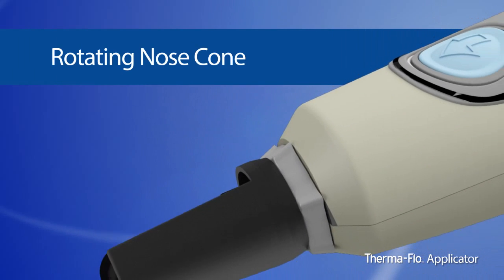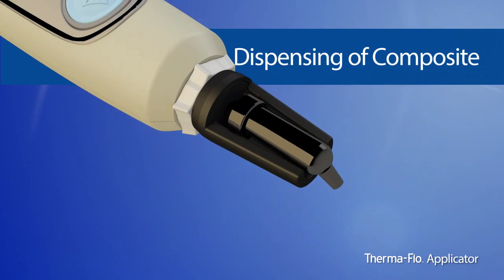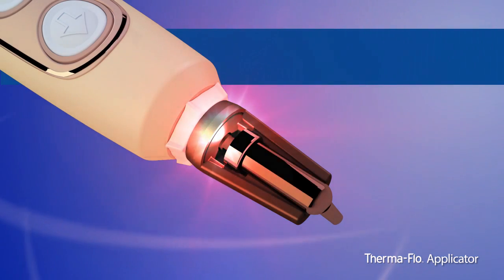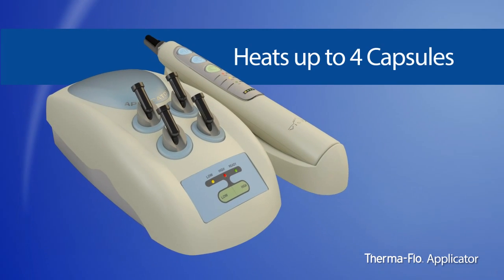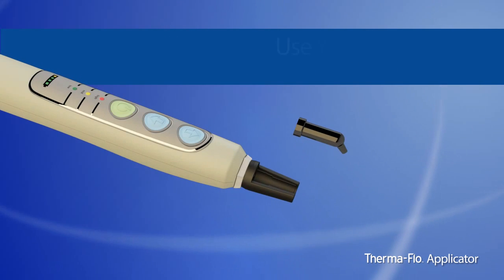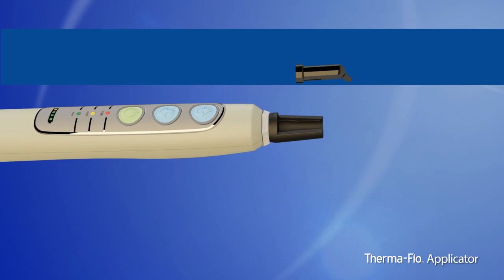The patented applicator is designed for heated, motorized extrusion of composite material. The handpiece heats at the point of delivery for optimal flow of composite, unlike any other device on the market. The base unit heats up to four capsules at a time and has two preset temperatures to ensure ideal handling properties. The applicator accepts most manufacturers' composite capsules, so dentists can continue to use the composite of their choice.